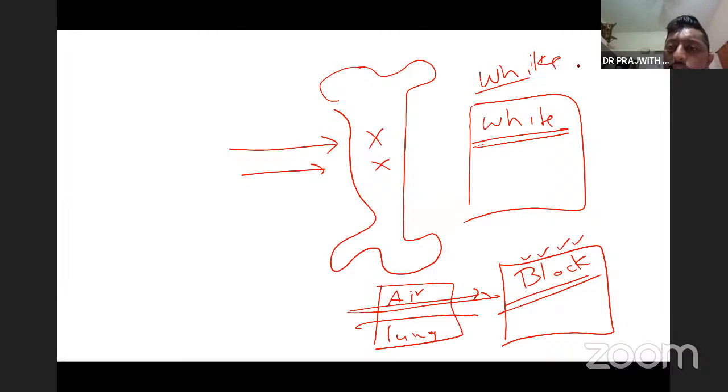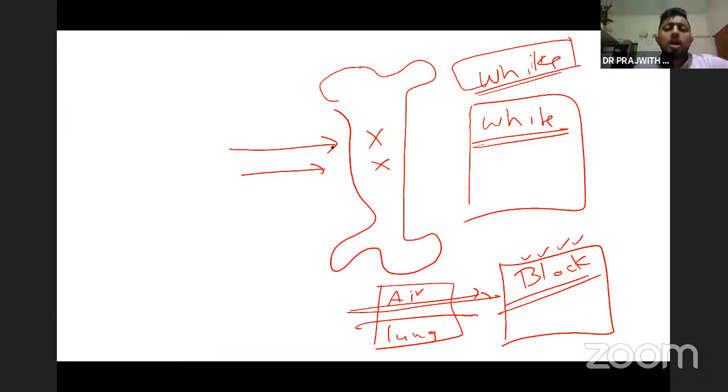So that is the principle of X-ray. Very simple. Now, we know that the bone will stop the X-rays maximally because it is a denser structure. So for simplicity, anything which is very dense will stop the X-ray maximally. Okay, so bone is dense.